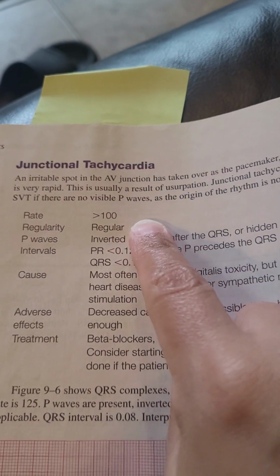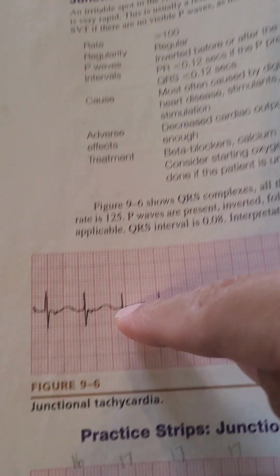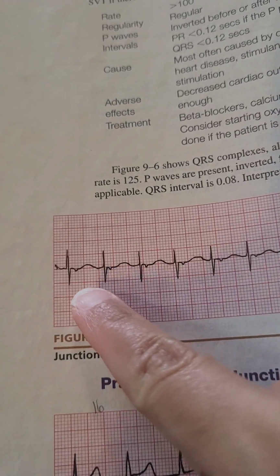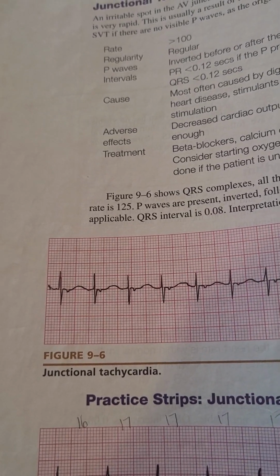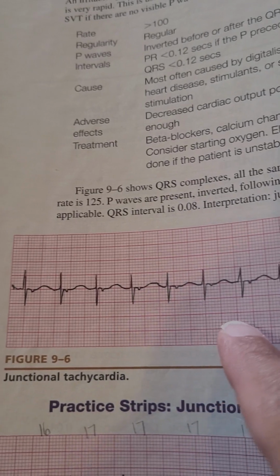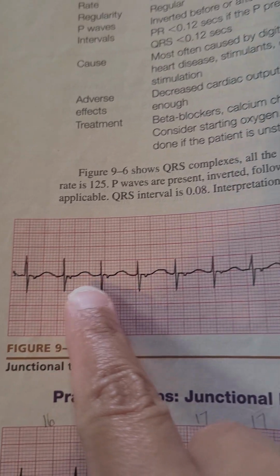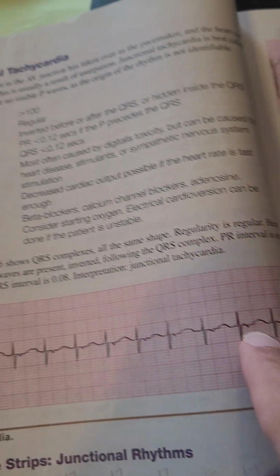Tachycardia means fast, right? Greater than 100 beats per minute. It's still regular. You see this? It's still regular, except the junctional is really messing with how you know it's with the P wave. So if the P wave starts to look funny, then most likely it's junctional. 1, 2, 3, 4, 5, 6, 7, 8, 9, 10, 11, 12.